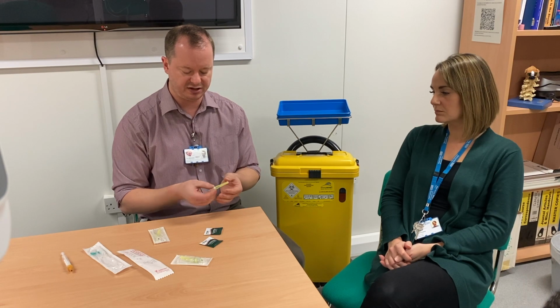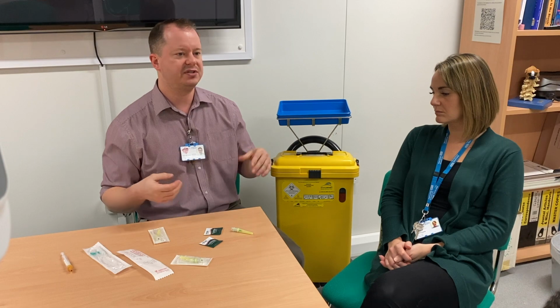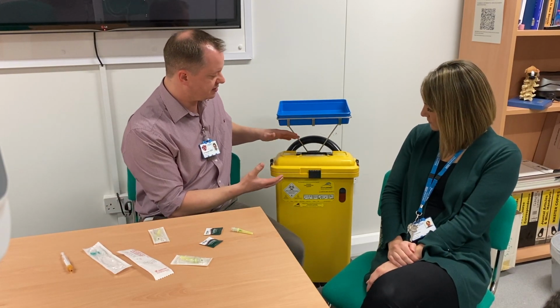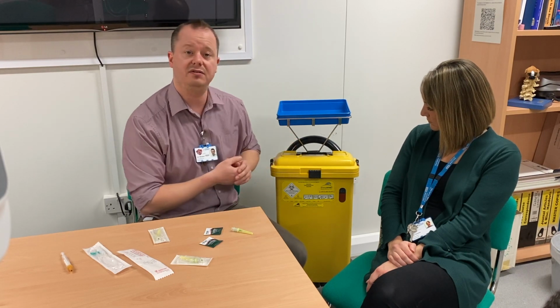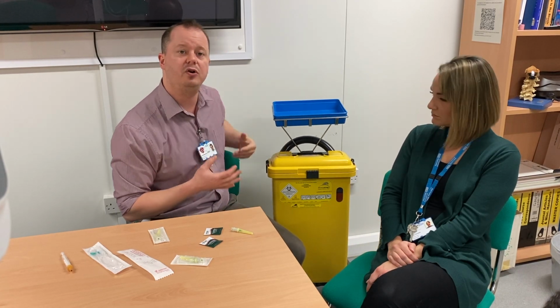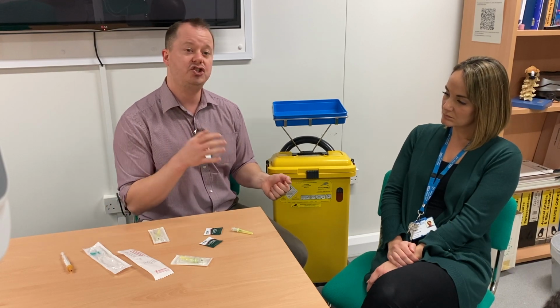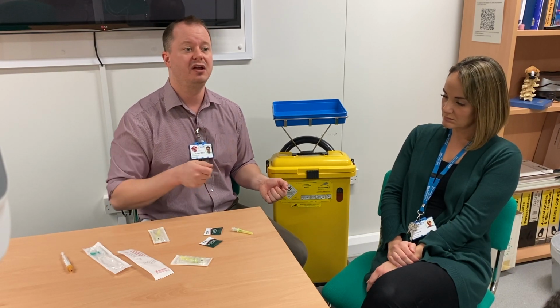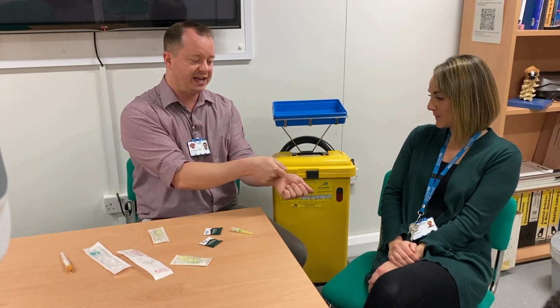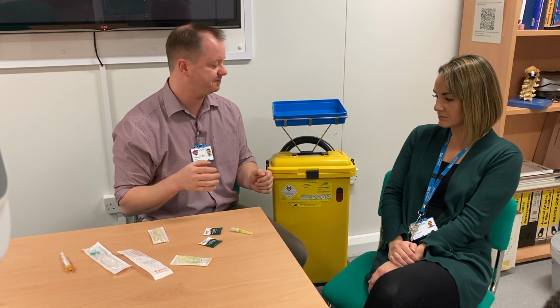In order to protect you, there are several things that we have apart from training to help you, and one of those is a sharps bin. It's an example of the Sharp Smart device that we use at West Suffolk Hospital. They are mobile trolleys on wheels that you can bring with you to your patient, and when you're performing any practical skill which involves sharps, it should be within half an arm's reach of you. So you shouldn't have to reach or throw or do anything. You should be able to just take your sharp directly out of your patient, and it doesn't go anywhere else, it just goes directly into the sharps bin.